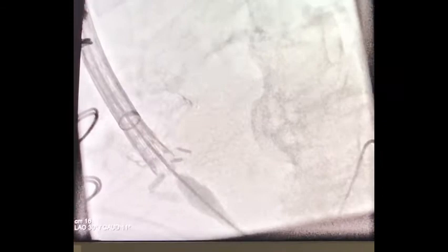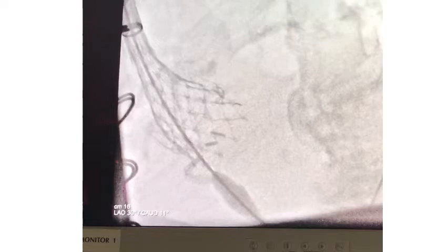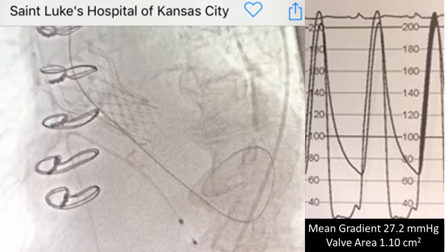At this point, the self-expanding valve is deployed in a standard fashion. During valve-in-valve, we take the parallax out of the surgical valve rather than the device, using fluoro in several different views to ensure the valve circumferentially seats within the sewing ring. It is difficult with valve-in-valve to see whether the self-expanding valve is positioned too deep or not deep enough. As with many valve-in-valve TAVRs performed in small surgical valves, we expected and indeed had a significant residual gradient of 27 millimeters of mercury.